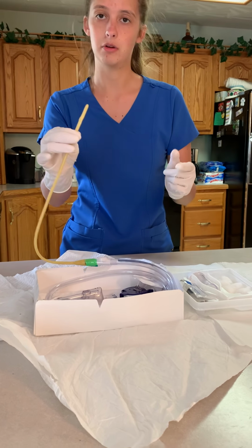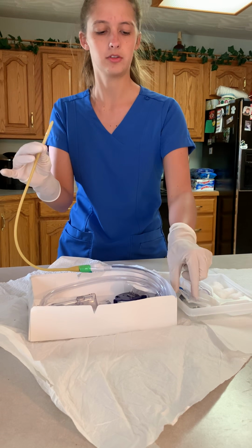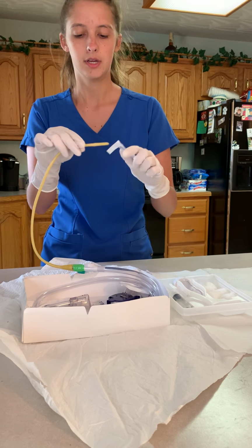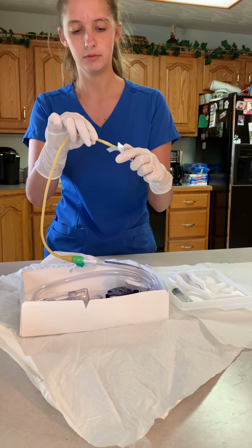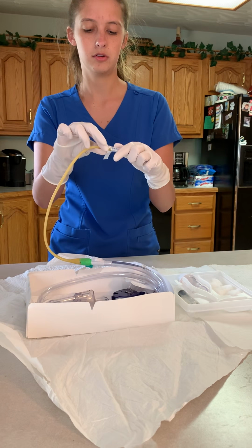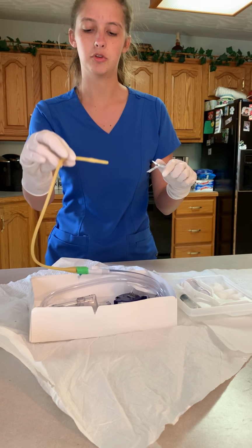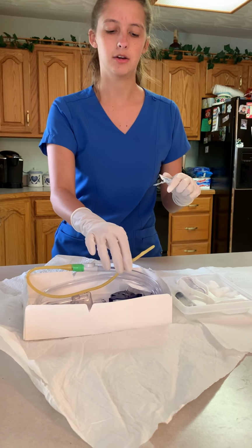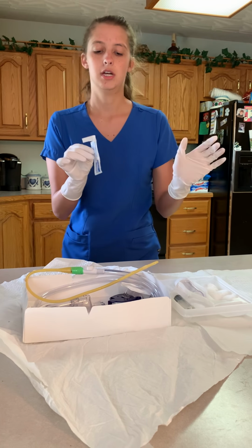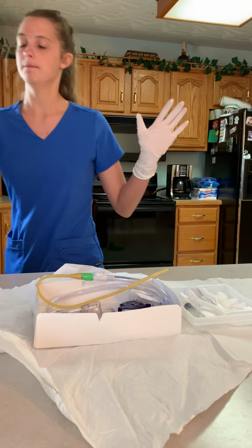Okay, so I'm not going to hold it more than 2 inches back when I lubricate it. So I'm going to get my lubricant. We're going to open it up. Again, we're not reaching over the sterile field. And we're not going back more than 2 inches. Okay, and now I'm just going to lay my tubing down right here so I don't cross over my sterile field. We're going to go out and away.